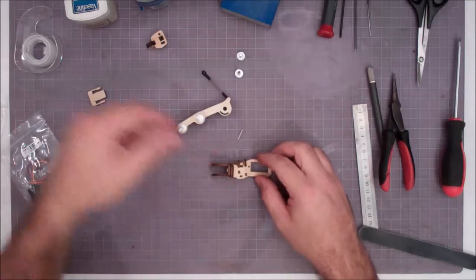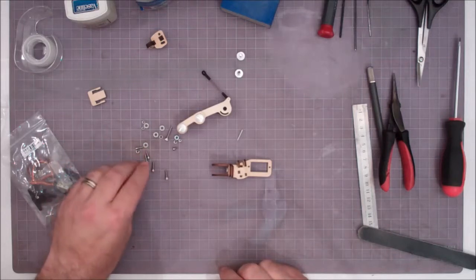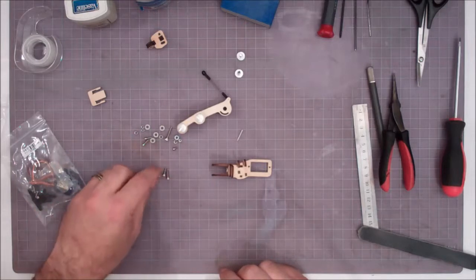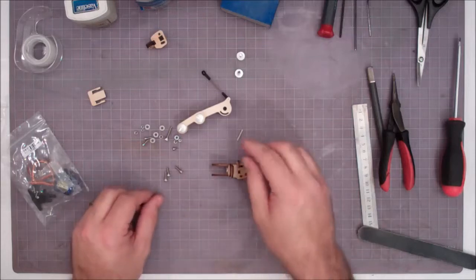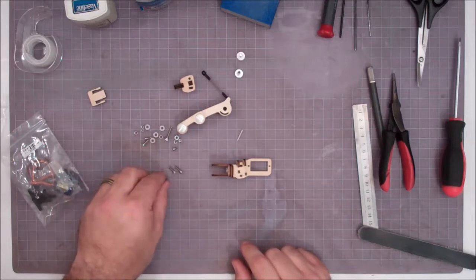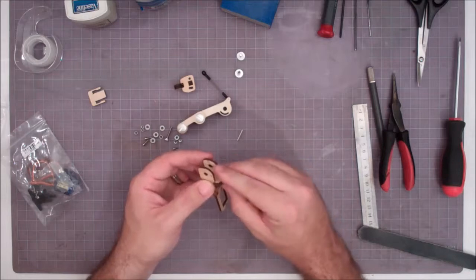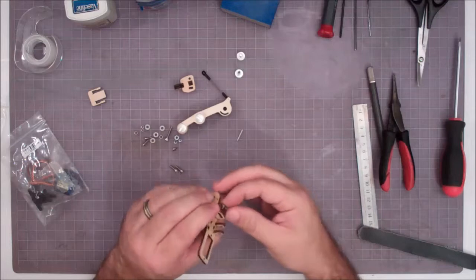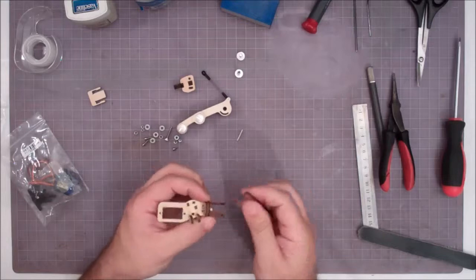So we're going to go ahead and place a screw. In this particular kit, you'll notice that you only have 3 of the short 440 screws that you would use to bolt the whole finger together. This plate only uses 2 versus the 3 that we used on the finger plate. So we're going to get one of those, and from the hole side we're going to insert it through the base there. Kind of a tight hole, so we'll screw it down in there.